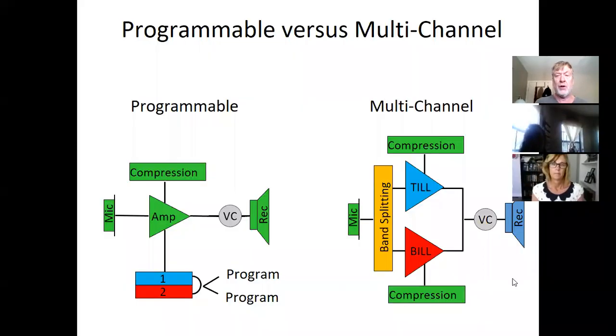That's for listening in quiet. That's for listening one-on-one, for talking like at the supper table when there's not too much background noise going on. But you might have a listener walking outside where it's noisy, and maybe there's a lot of traffic outside. And you want to then use program 2 for listening in noise. And what's the hearing aid going to do then? Well, you will decide what you want it to do. And this happens on all digital hearing aids, all of them.